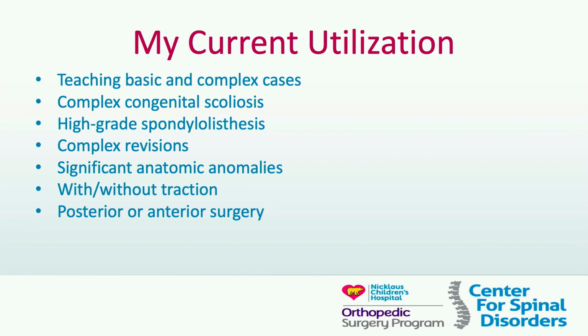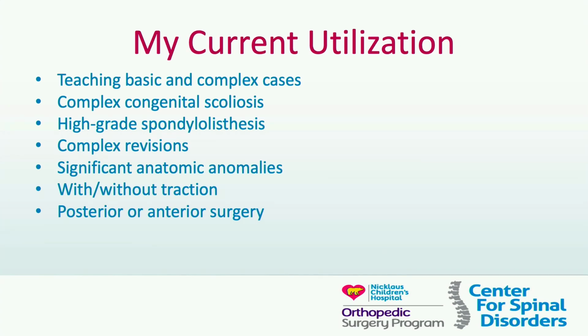In my current state, I utilize it a lot for teaching, and a lot for my complex cases, whether it's congenital scoli, high-grade spondies, complex revision where you have really distorted anatomy, or any patient with significant anatomic anomalies. And you can use this for just about anything, whether it's with or without traction, which we do on some of our bigger deformities. And it can be used in posterior and anterior surgery.